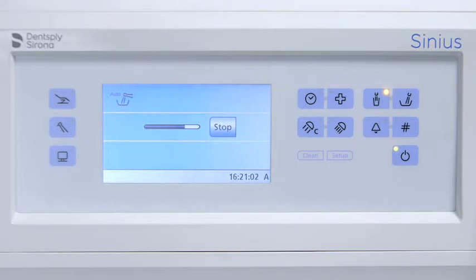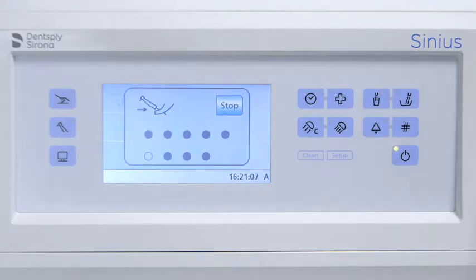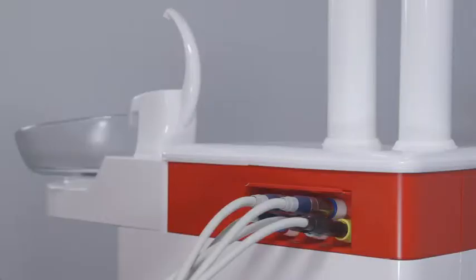Leave the hoses and the adapters after the end of the program. The auto purge program starts automatically in the morning when you switch your treatment center on.